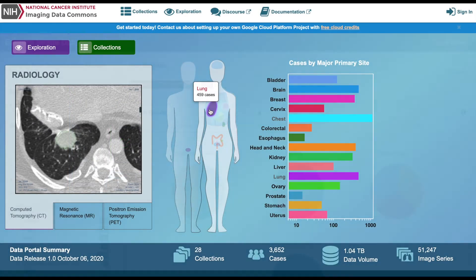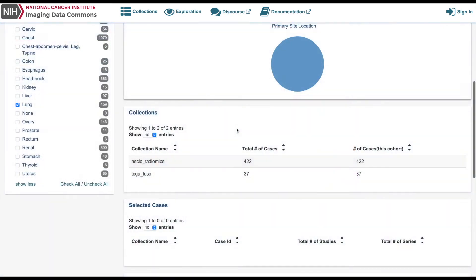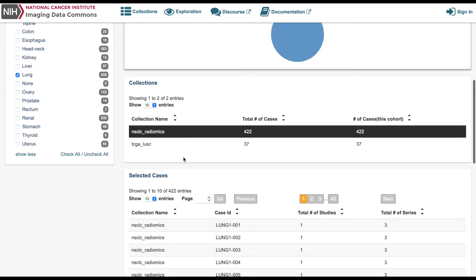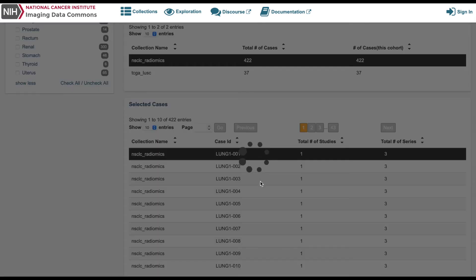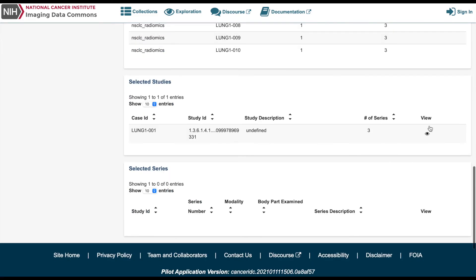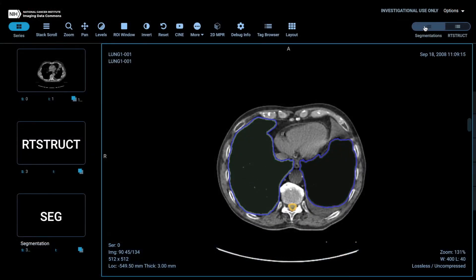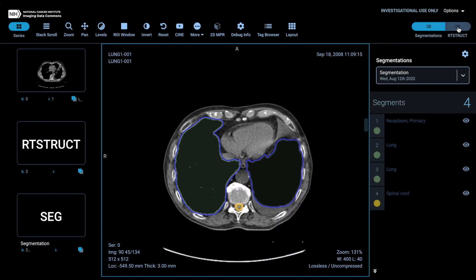The non-small cell lung cancer radiomics dataset can be accessed at the IDC portal by browsing the collection for lung, and can be easily explored using the IDC viewer with just a couple of clicks.